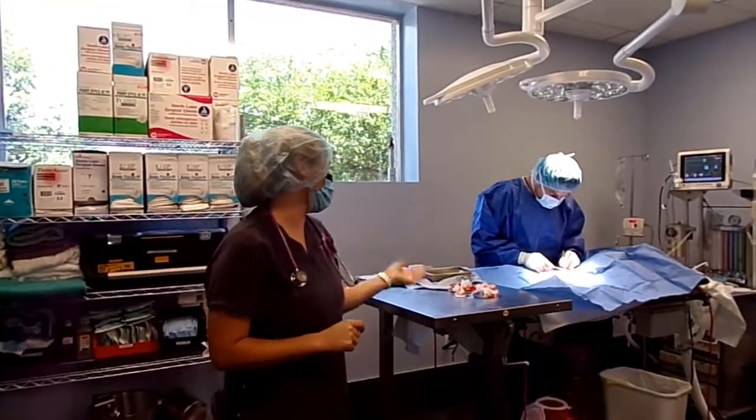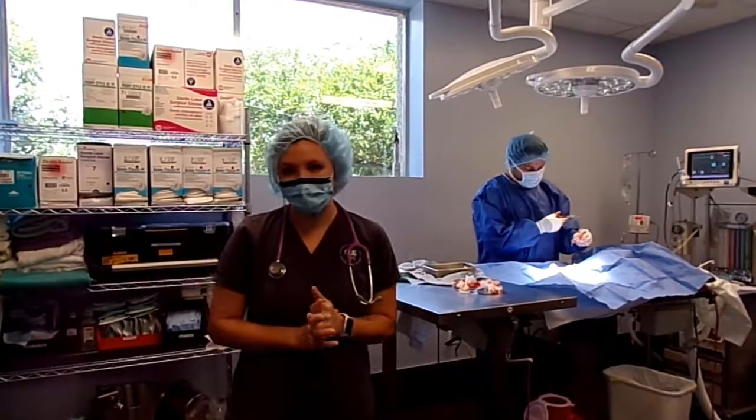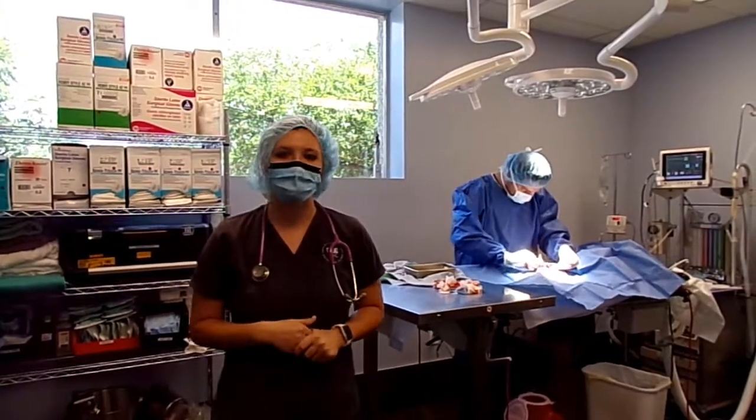Our DVM is finishing up the spay right now and is closing the incision. LVTs can close incisions — they can close when it's just the outer skin — but here at Hillside we move pretty quickly, so usually our DVMs finish up.